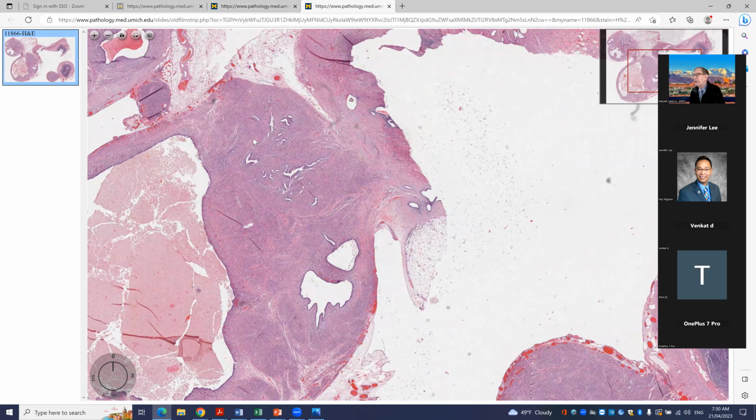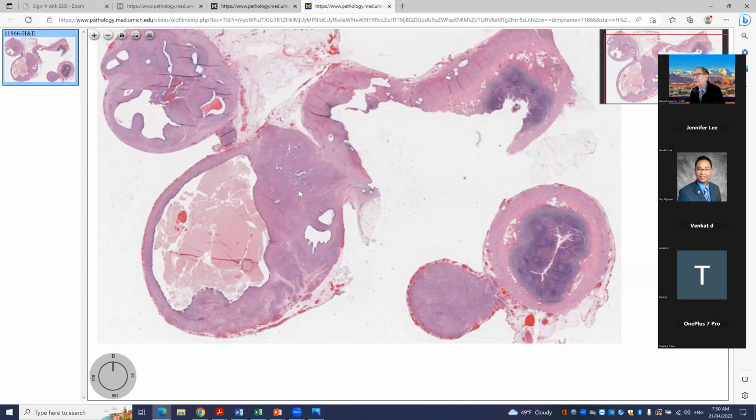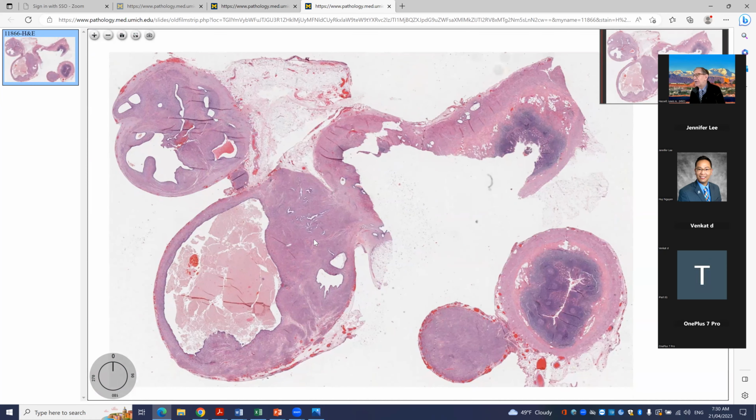But where we're involving peritoneal surfaces, people have used the term leiomyomatosis peritonealis disseminata. That doesn't include the glandular component particularly well. So I suppose you could use the term adenomyomatosis disseminata peritonealis or something like that. If you were a Latin scholar, you could come up with the right endings and suffixes for that sort of thing. But essentially, this is adenomyosis that has disseminated to the peritoneum.